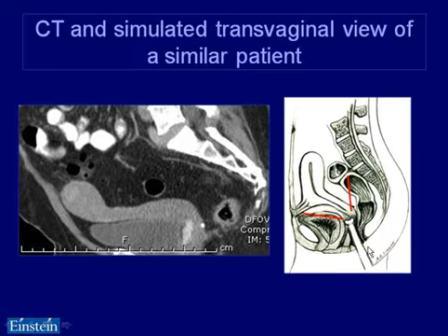So if you put the probe in the vagina, which would be about here, and you image, you'll get an absolutely wonderful view of the cervix. And it will be so elongated that some people think that's just the uterus. And you may never really be able to image the body of the uterus, which is up here.